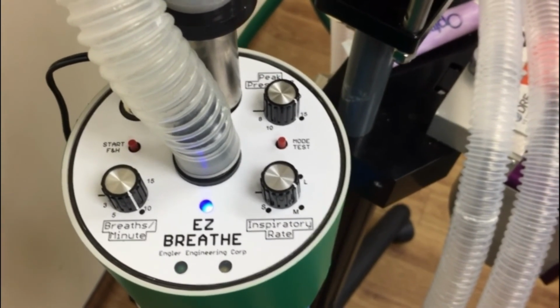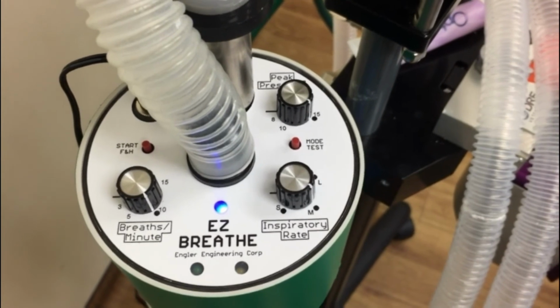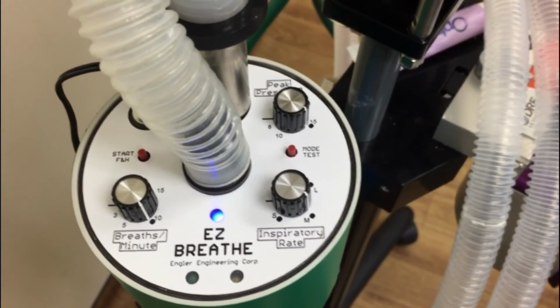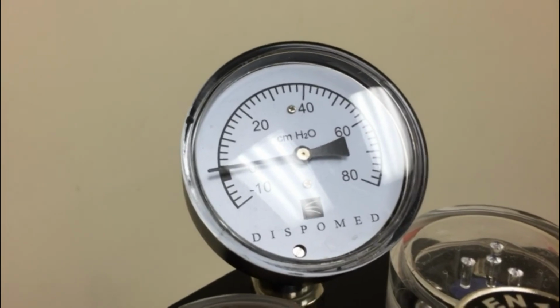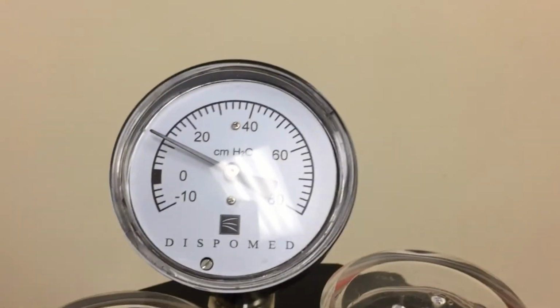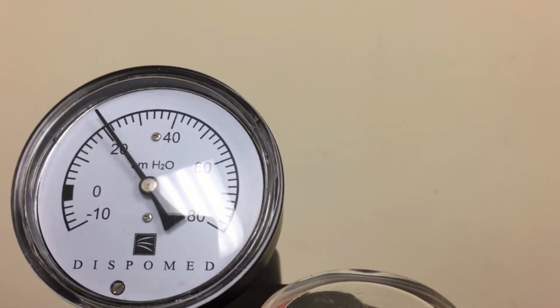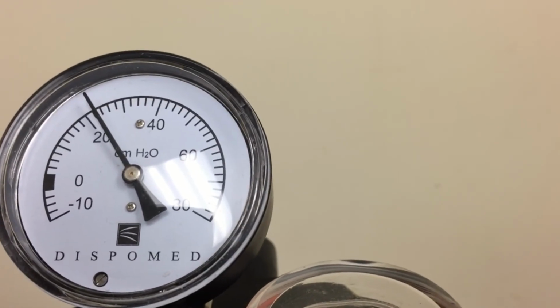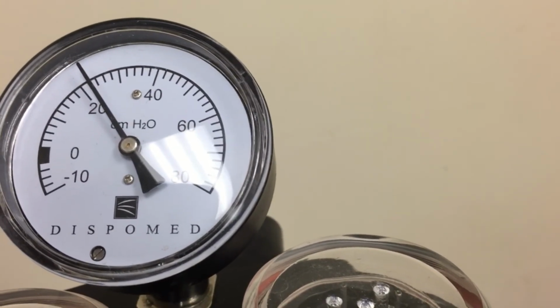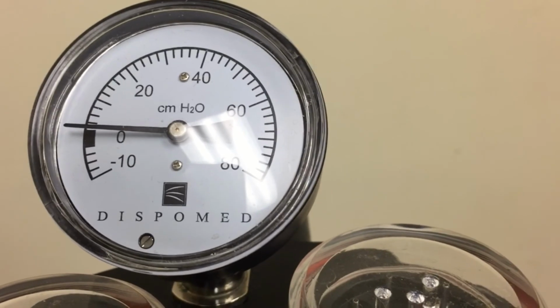The second function is a test mode. This mode is used to test the integrity of the inner bag and the anesthesia machine itself. To enter this mode, press and hold the button. You will see that the pressure starts to slowly come up. This shows the pressure rising from the flow meter. I now shut the flow meter off, and it holds at 20, proving the integrity of the anesthesia machine. If there was a leak, what would happen is the pressure would start to slowly decrease. Releasing the button lets the pressure release from the system.